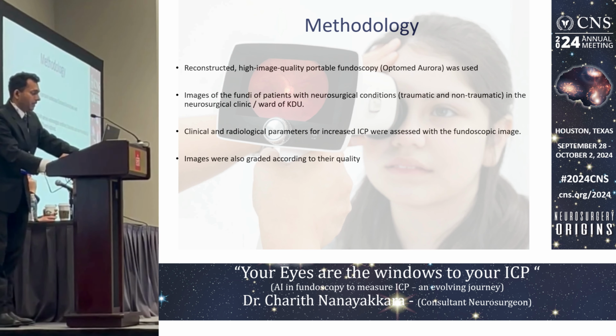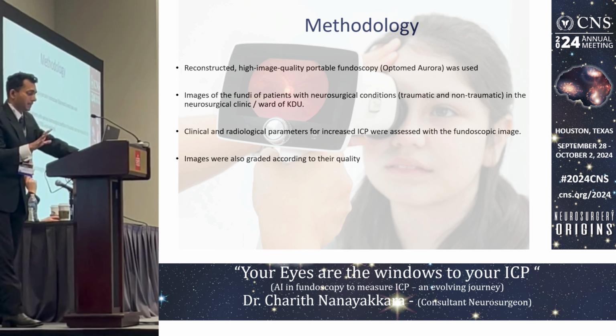Right. So we used the reconstructed high image quality portable fundoscope, Optomed Aurora, and images of the fundi of patients with various neurosurgical conditions, maybe traumatic, and even some non-traumatic patients in the neurosurgical clinic and ward at KDU, Defence University, which is where I practice, were captured. Clinical and radiological parameters, which are used as a proxy for the increase in ICP, were assessed with the fundoscopic images. These images were also graded according to their quality: excellent, fair, and good.